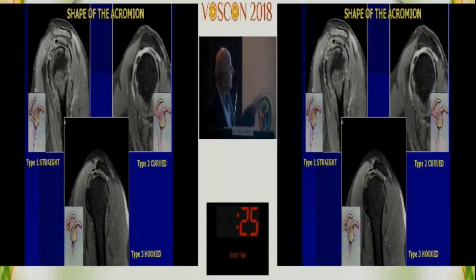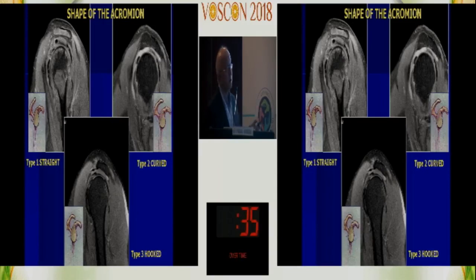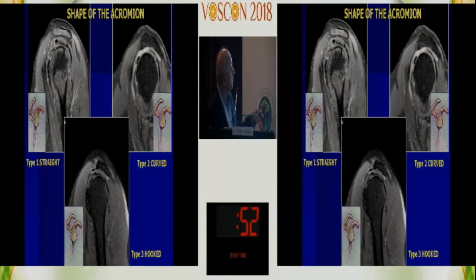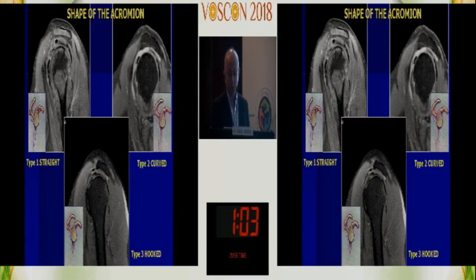The sagittal obliques are important — again top to bottom, out to in. You're looking at the shape of the acromion: flat is type 1, curved is type 2, and hooked is type 3. On the sagittals, identify the rotator cuff — tendons are dark in all films, so you can identify the supraspinatus, infraspinatus, biceps, and subscapularis. This also identifies the rotator interval, the coracoid, and coracobrachialis. The sagittal obliques tell you the acromion shape, subacromial space, tendon status, and the rotator interval — important in diabetic frozen shoulder.